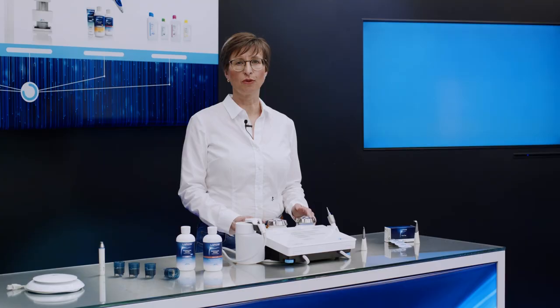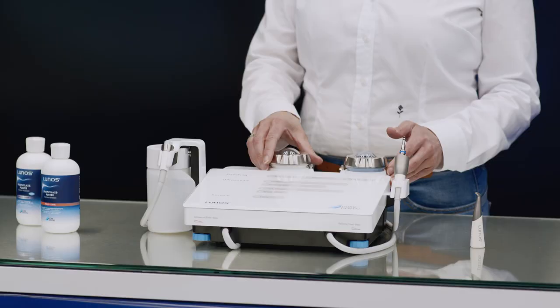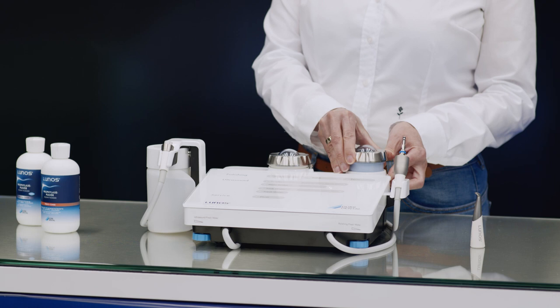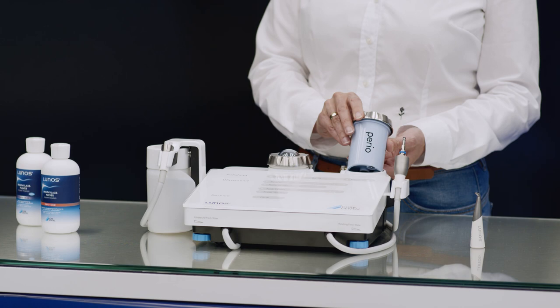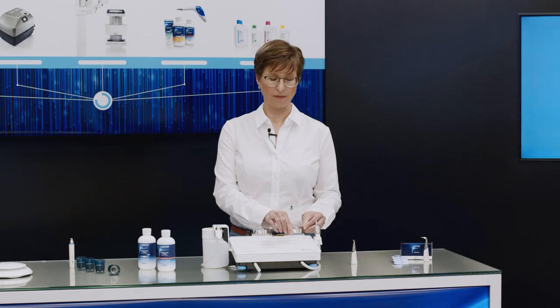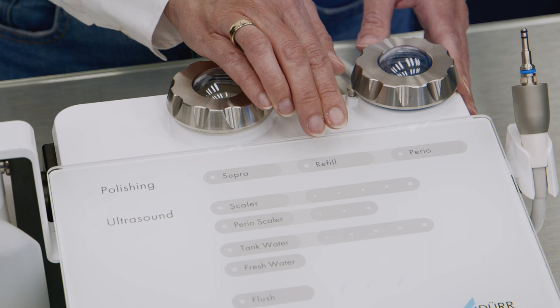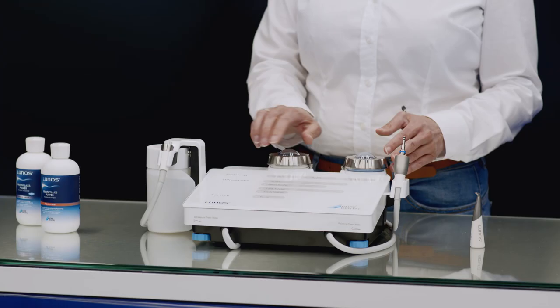A total of two powder containers are provided in the device. The supra container is used with the powder jet handpiece in combination with the supra function, while the perio container is used with the perio function. You just need to remember to relieve the pressure by pressing the refill button. The containers are then refilled simply and cleanly while still in the device.